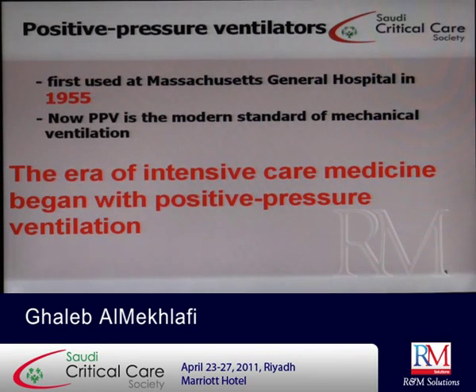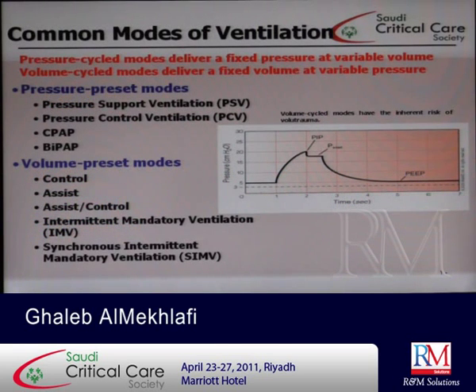Now the positive pressure ventilation was first used in 1955, and now it is the modern standard of mechanical ventilation, and the era actually of the intensive care medicine began with positive pressure ventilation. So it is the backbone of service in the ICU. Now, when we talk about positive pressure ventilation, we are talking about modes, because the negative pressure ventilation is only one mode. Okay, but in positive pressure ventilation we have different types of modes. We can either move the chest or the airways by pressure only and flow, or by volume directly.